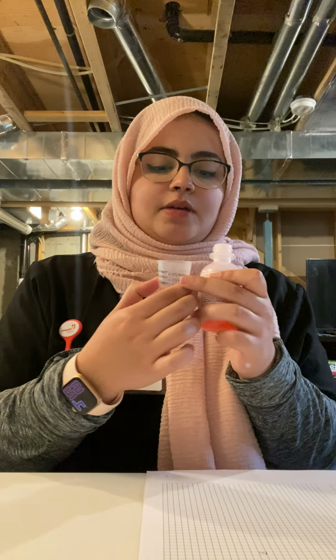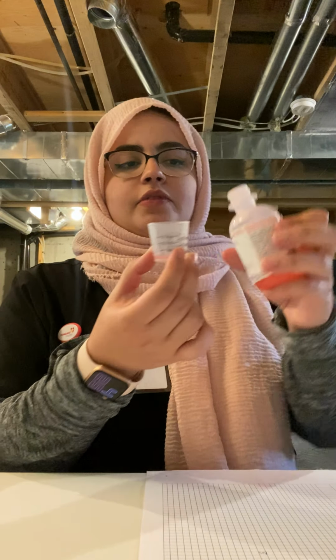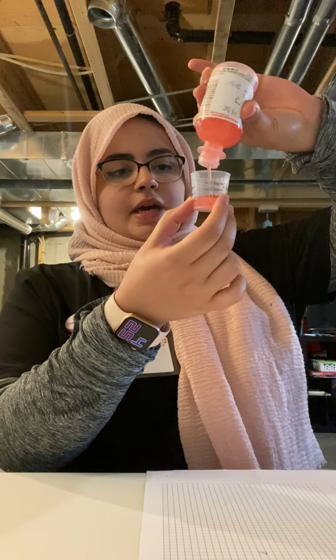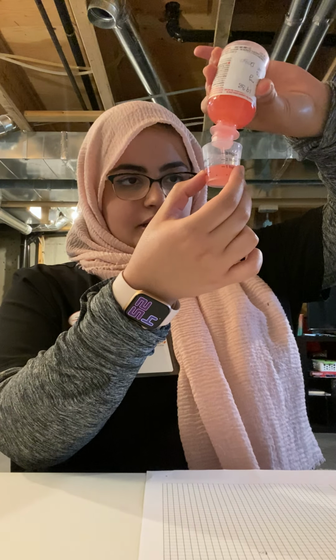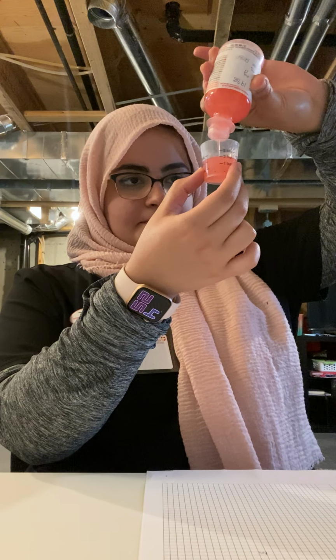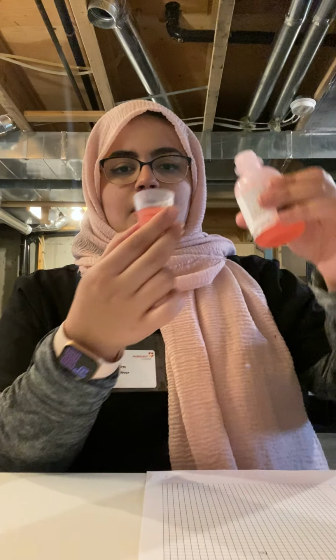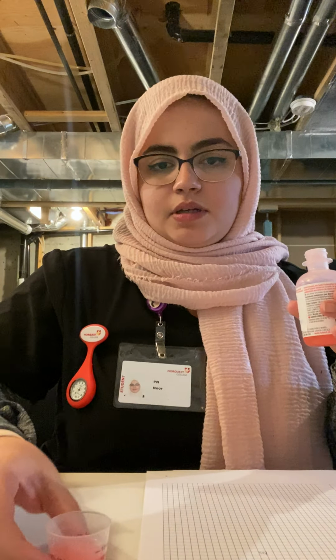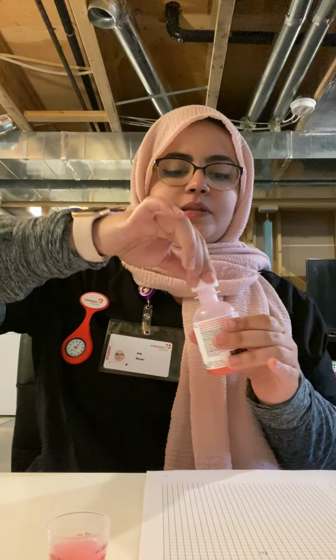Making sure not to contaminate any of the top parts. Pouring out 10 milliliters at eye level to make sure that I don't go above 10 milliliters. Okay. I have exactly 10 milliliters right now. Being aware not to contaminate it.